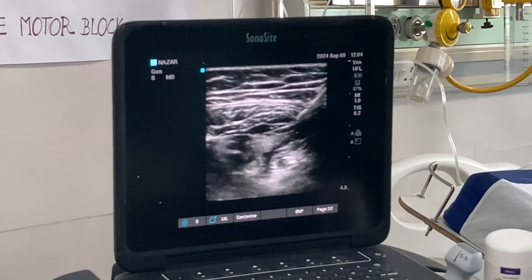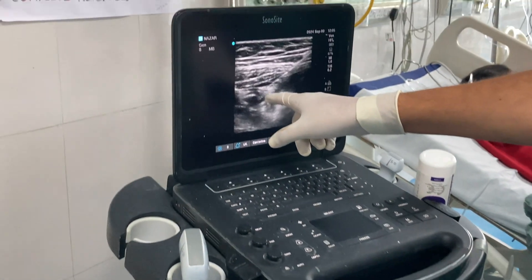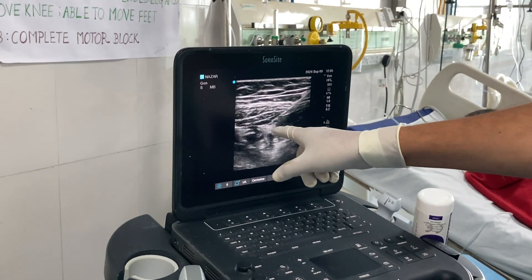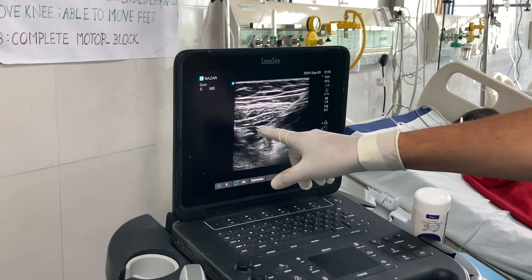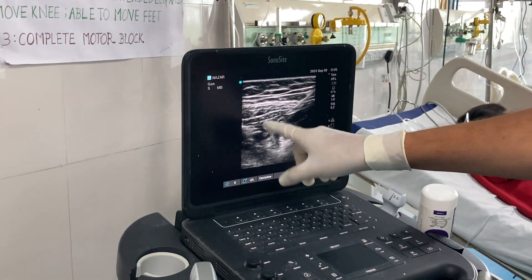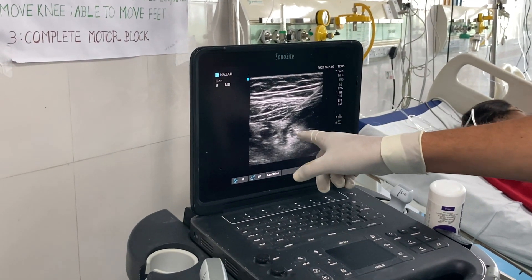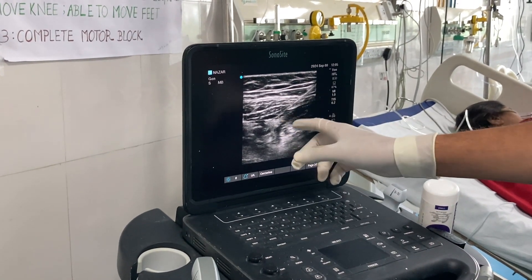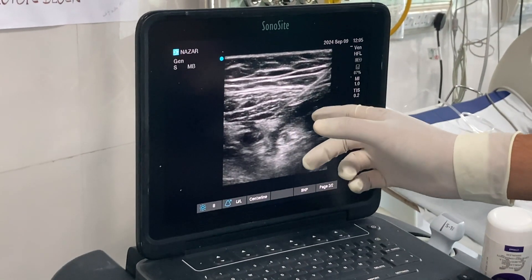You can place the catheter over the femoral artery or wherever you want to place it.